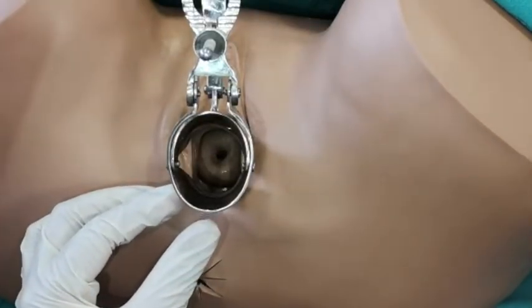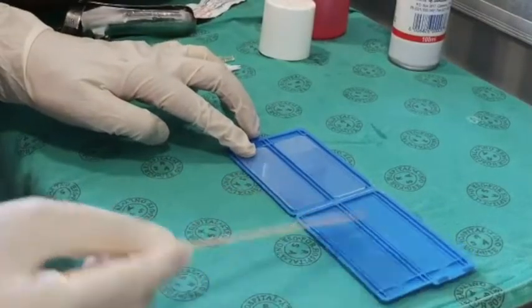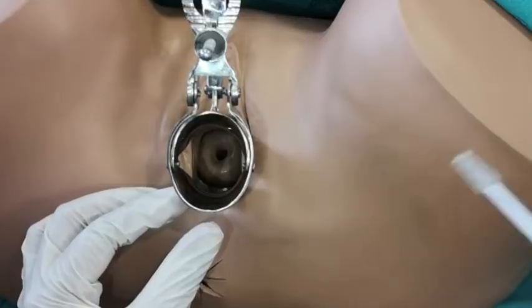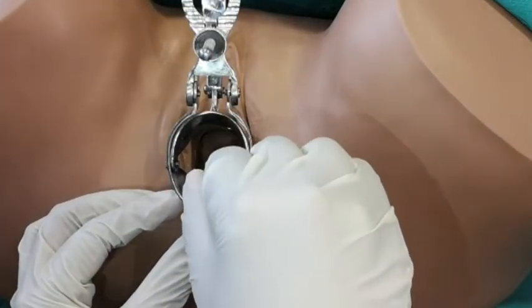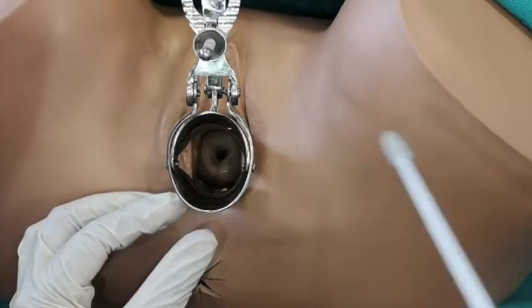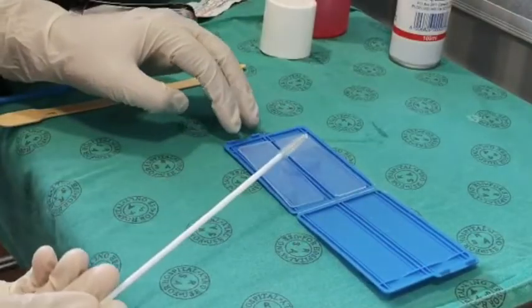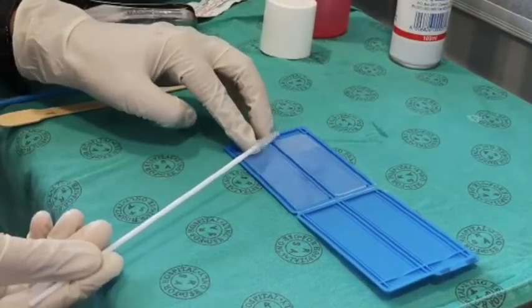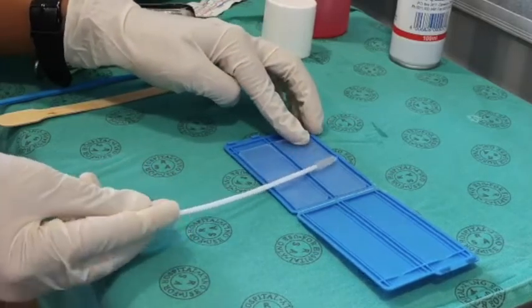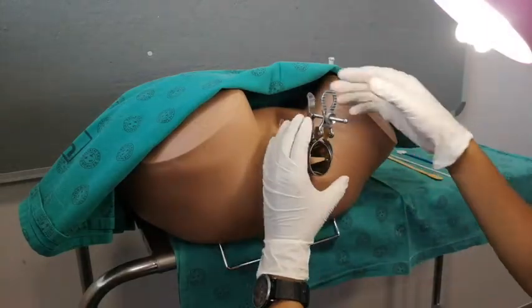Immediately smear it onto your first slide. Now take your endo brush, insert it into the endocervical canal, turn it 360 degrees, and immediately smear it onto the second slide. Be careful to avoid the opaque part of the slide, which you will be labeling later on.